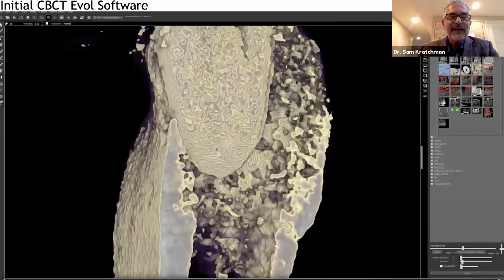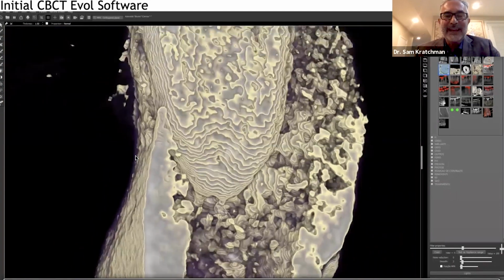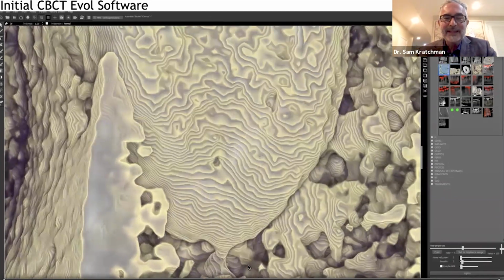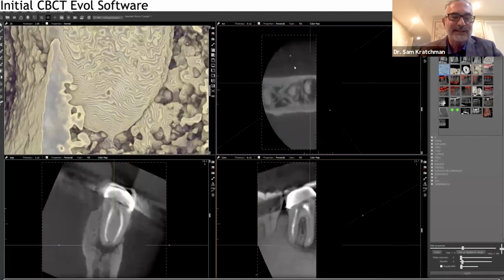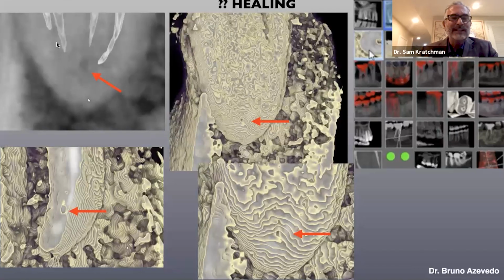And look here, he almost pixelates this. And that is a lateral canal. This is very cool stuff coming off of that root, feeding into the lesion. So these are slices that he's put into this new software that he has. And he assured me by comparing the 2 scans that that was actually spongy bone, or new bone that was being formed.